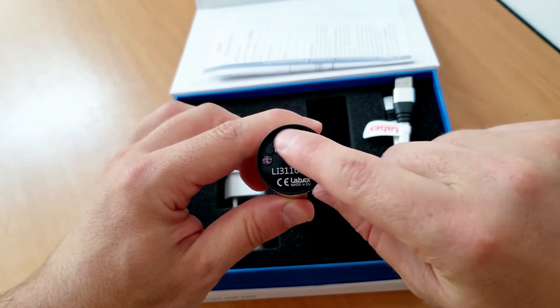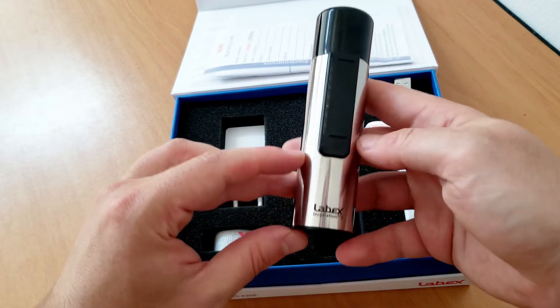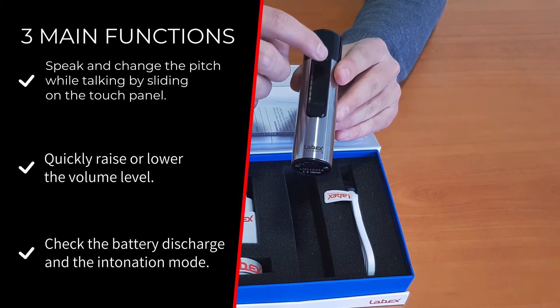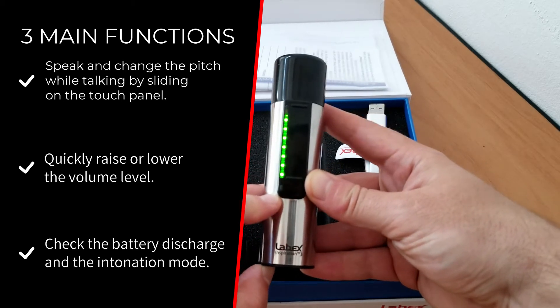To use the device, you must turn it on from the switch at the bottom cap. Everyday usage consists of three simple functionalities: speak and change the pitch while talking by sliding on the touch panel, quickly raise or lower the volume level, and check the battery discharge and the intonation mode.